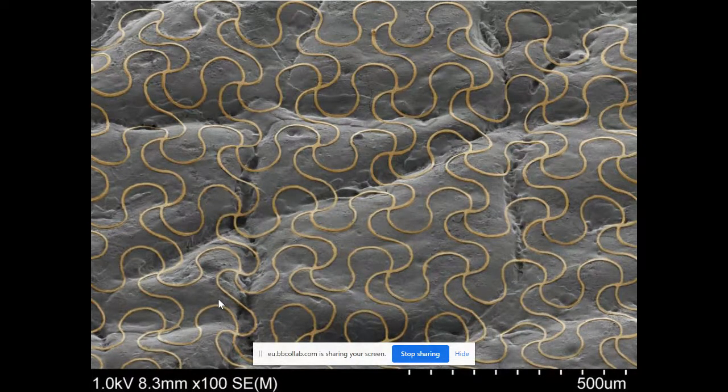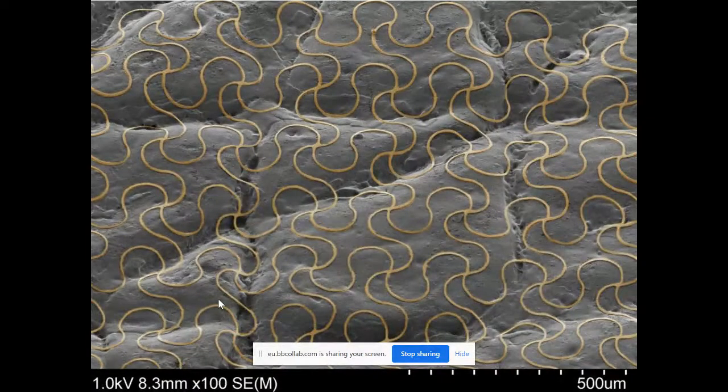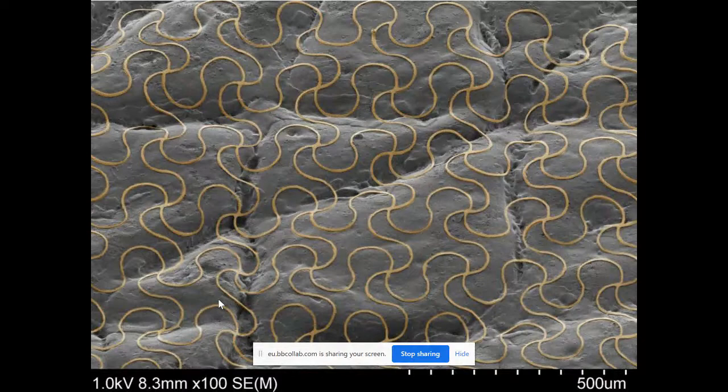This is an example of an interconnected filamentary serpentine mesh. It's an electrode structure, but you can build devices directly into that kind of framework. When integrated with a silicone elastomer, for example, you can achieve effective Young's moduli that are matched to the skin, in spite of the fact that those filaments embed very high modulus brittle materials like silicon. And that's from a mechanics standpoint, but the geometry is also very powerful because it allows you to conform to very heterogeneous, rough surfaces, as illustrated here in the case of a polymer replica of human skin.